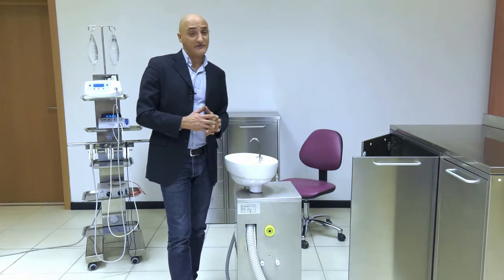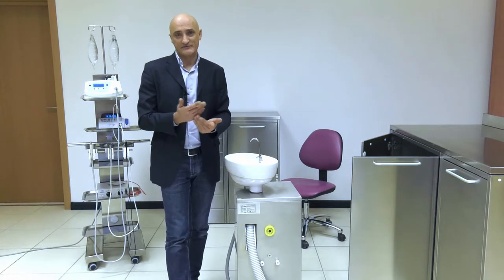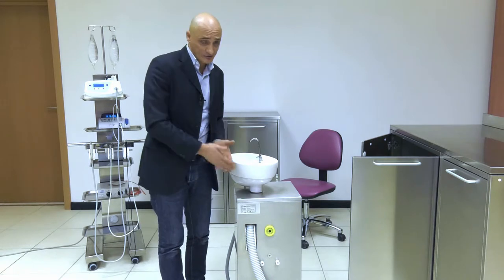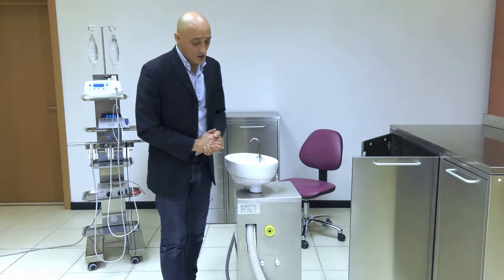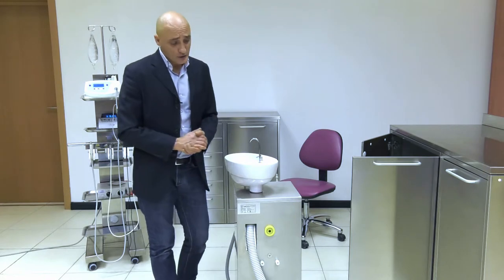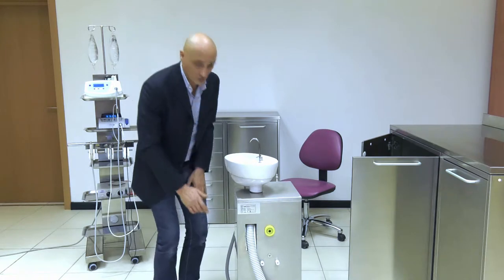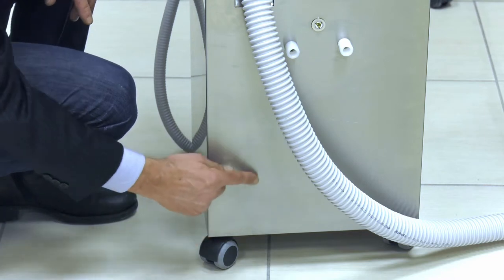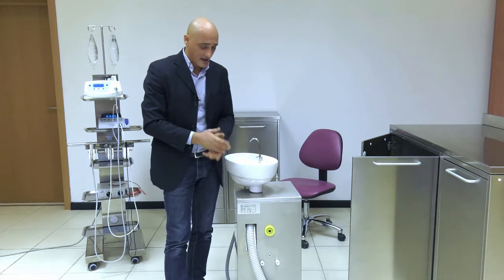Upon specific request — you will have to call us, as this option is not available in our configuration system — it is also possible to fit the separator into the cart. Clearly, there will be an additional hindrance; for example, the pipe to release the water, which will be positioned here. Therefore, there will be an additional pipe down below that will allow you to drain the cuspidor water separately.